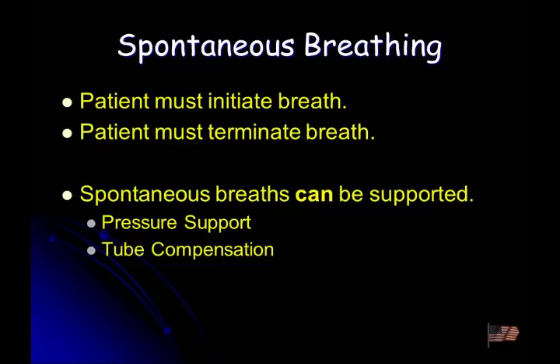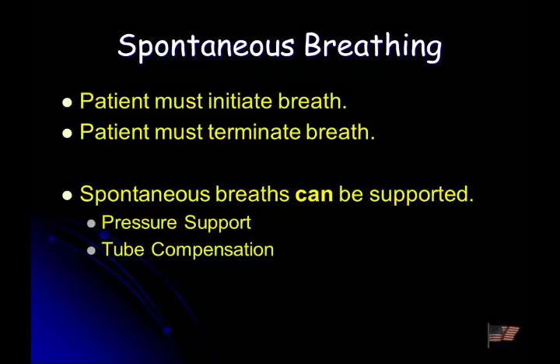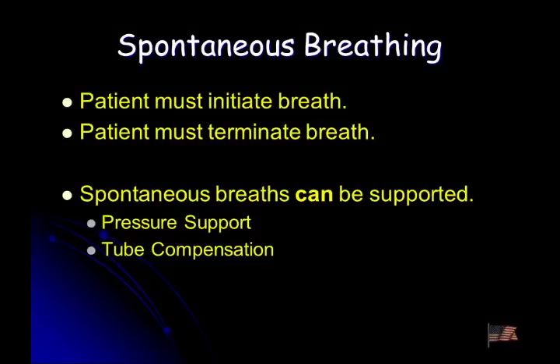So, when we talk about a spontaneous breath, specifically, it's initiated by the patient, it's ended by the patient. Always, always, always. If the breath is started by the machine, it no longer becomes a spontaneous breath. When you say it's ended by the patient, is that because you have the inspiratory time set appropriately? If I'm setting an inspiratory time, it's not ended by the patient. Then it's no longer spontaneous. Gotcha, okay. But with the spontaneous breath, it has to be started and ended by the patient.